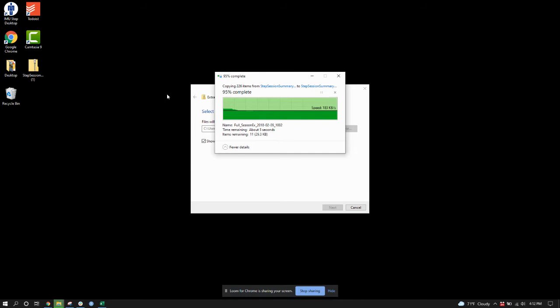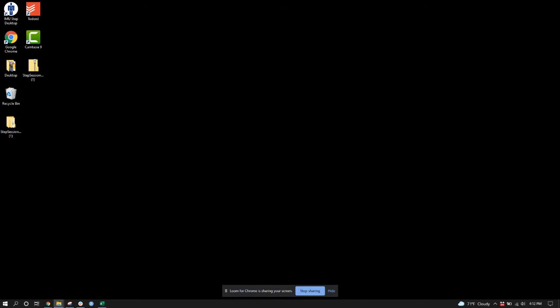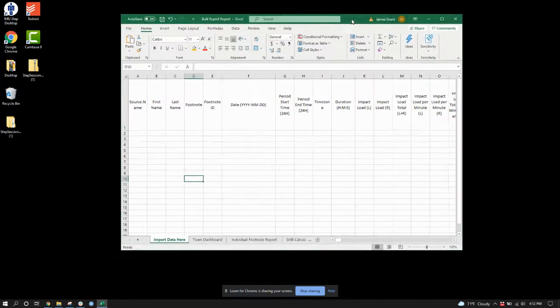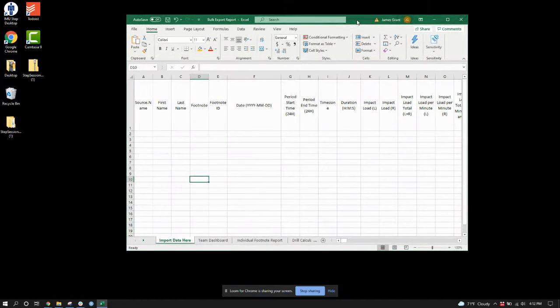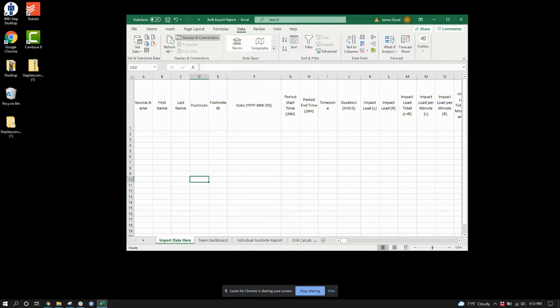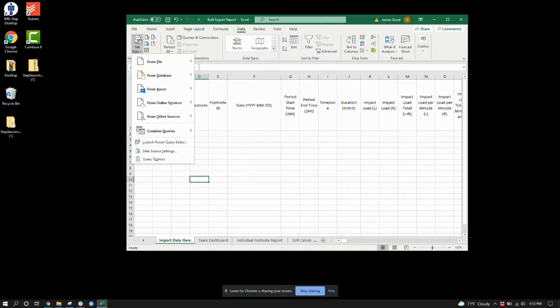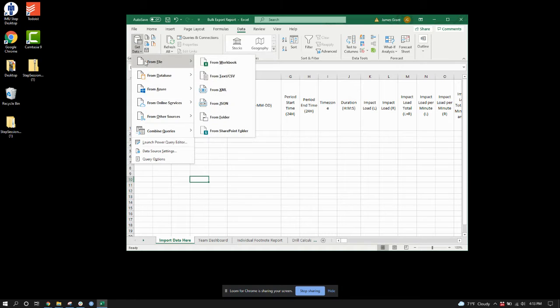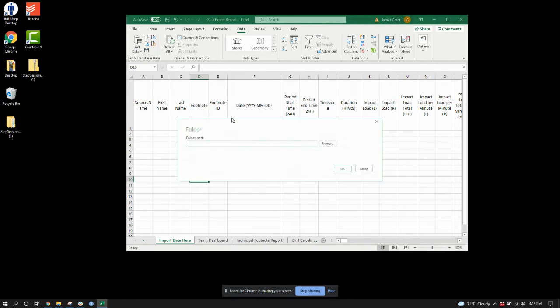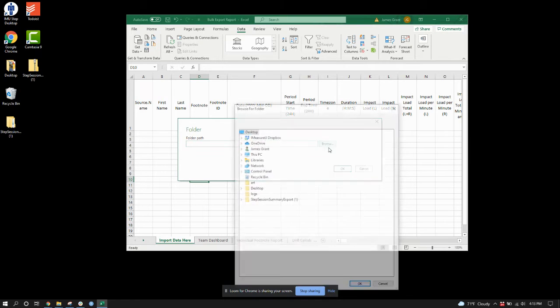Now I'm going to pull up the Excel report that I want to import this to. To start, I'm going to go to Data, Get Data, from File, from a Folder, and I'm going to select that folder that I just unzipped.